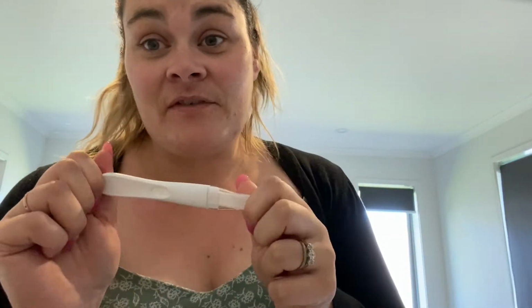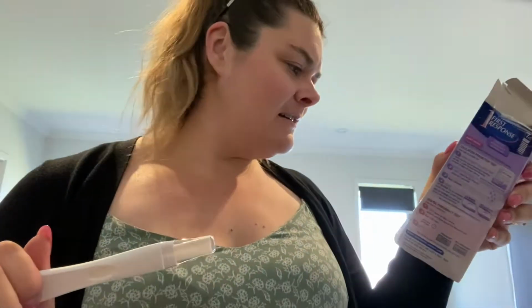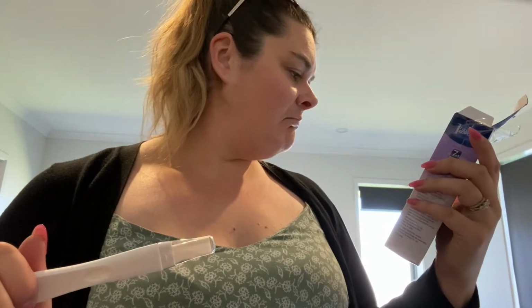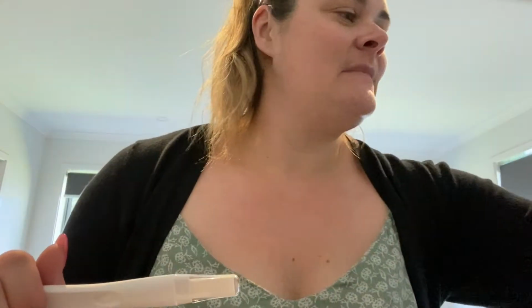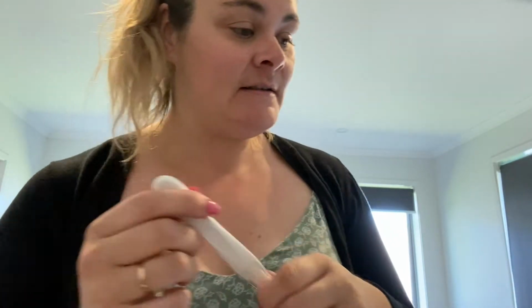But anyway, you dip it for the same amount. No, you don't. Give me a second. Yeah, okay, so you dip it for as long as you would a pregnancy test. So I'm going to dip this one first.